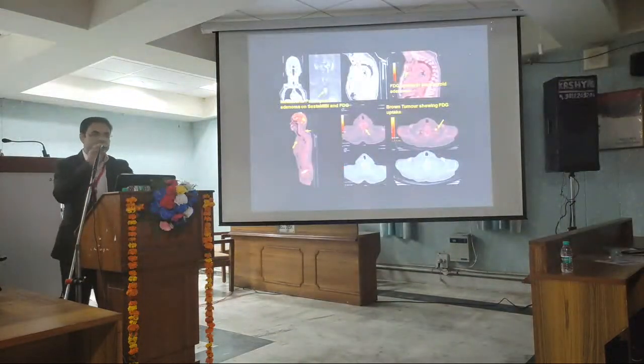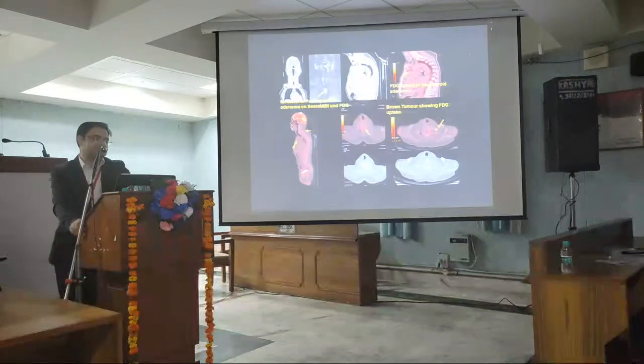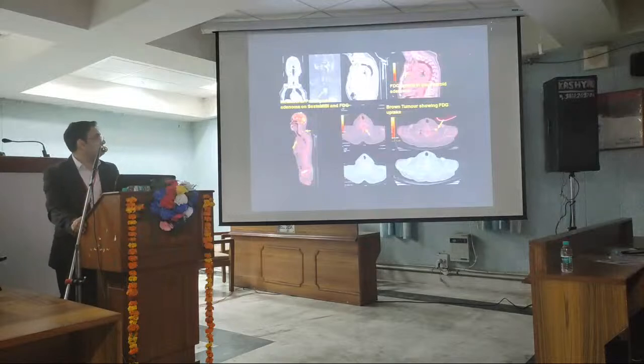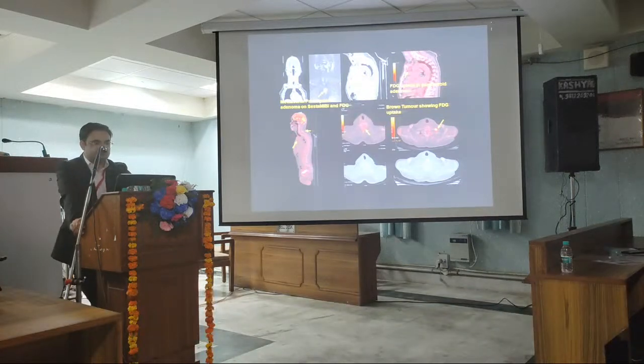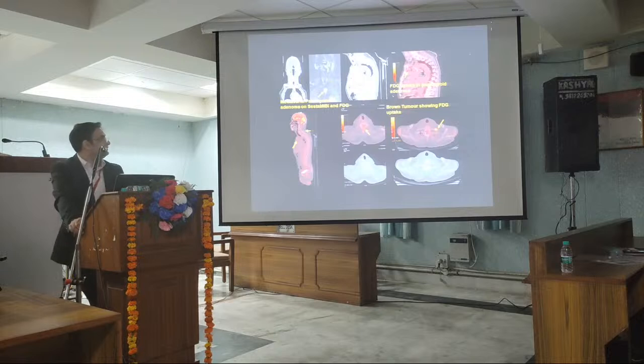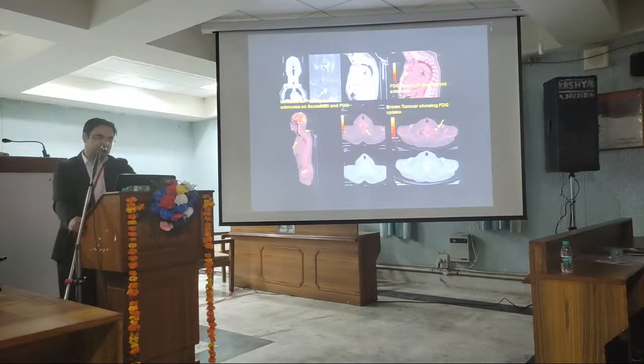Sometimes the patient may present to the clinician not directly with a diagnosis of parathyroid adenoma or a raised PTH level. Sometimes the patient may present with unrelated symptoms, like this patient who presented with diffuse bony pain. MRI was done, and it was suggestive of multiple altered signal intensities, suggestive of bony metastatic disease. But when we did the FDG PET CT, there was an ectopic tissue in the retrosternal region, and to confirm it was a parathyroid adenoma, we used the sestamibi scan. The multiple lytic lesions are suggestive of brown tumor manifestation of the parathyroid adenoma.